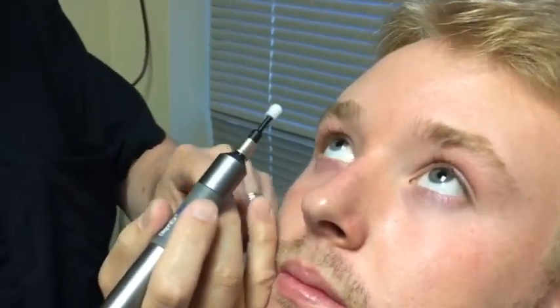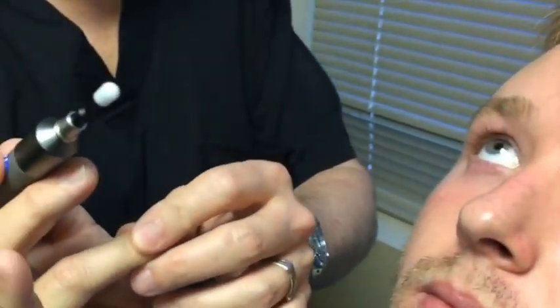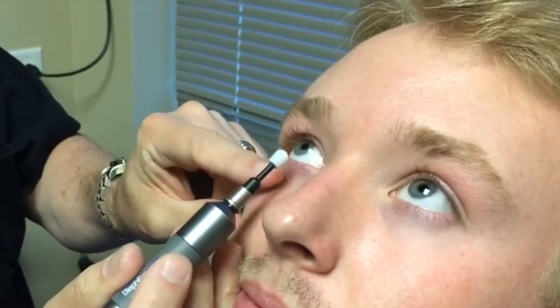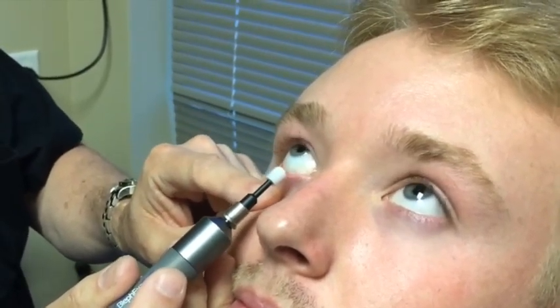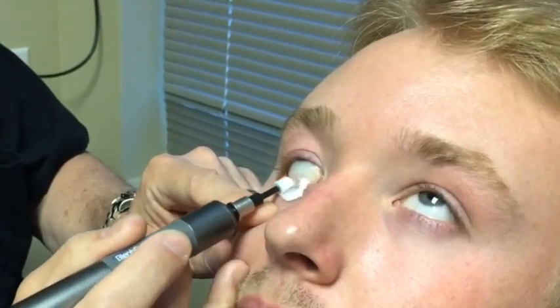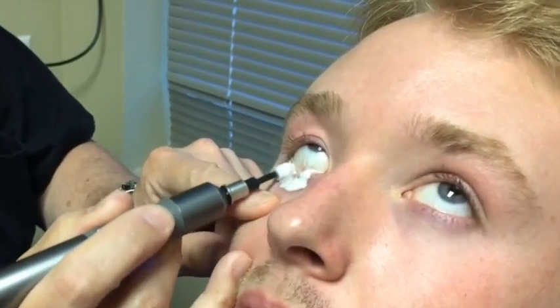I'm not coming in like this with the tip up or floating in the air trying to freehand it. I brace my hand on the cheek, and it's sometimes helpful to bring that finger in, collapse the hand so you can get down nice and low, just like this. You stay parallel to the nose so the face of the sponge is on the lid margin. Now pop that lid margin down off of the globe, and then you just go to work. And it's a nice firm pressure.